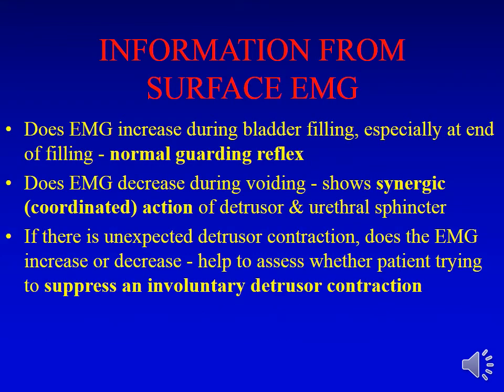Now, what's the information that we need to know from the surface EMG? Firstly, we need to know whether EMG increases during bladder filling, especially at the end of the filling. This is known as a normal guarding reflex. Does the EMG decrease during voiding? This should decrease. It is known as synergic action of detrusor and urethral sphincter.